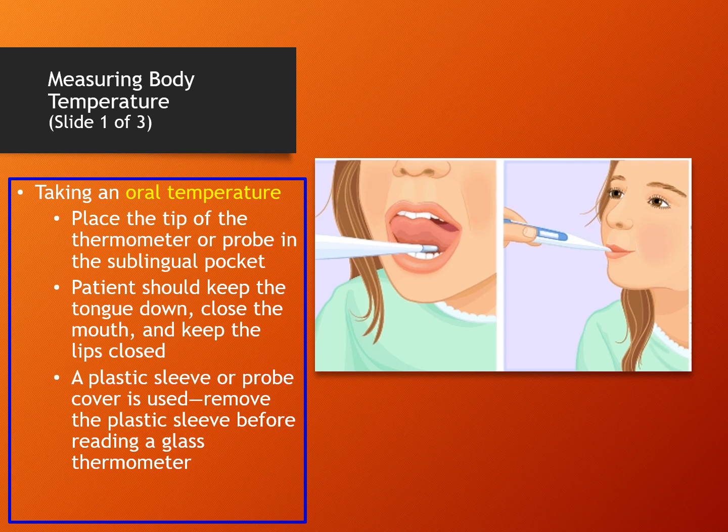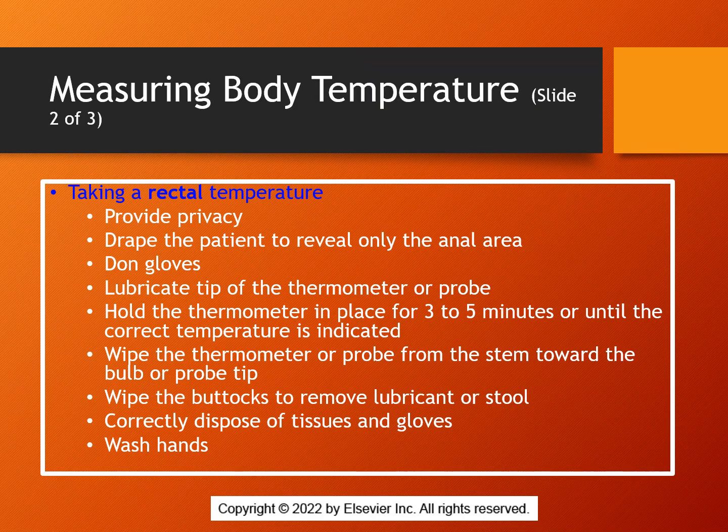If you're old like me, the only thermometers we had when I was a kid were the glass ones that had mercury in them, and you had to shake it down to get the mercury down, and then you had to hold it in your mouth, and it took forever. I think it's 3 minutes is normally what they say it takes. I haven't even seen one of those thermometers in years, but it's here in the PowerPoint somewhere.